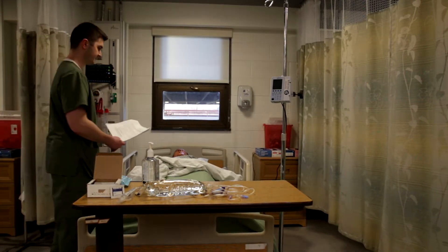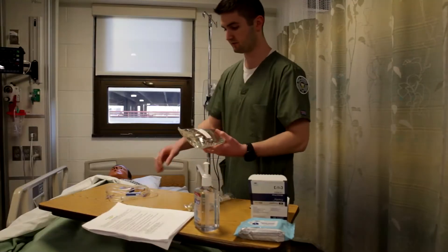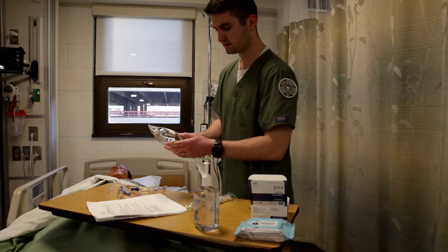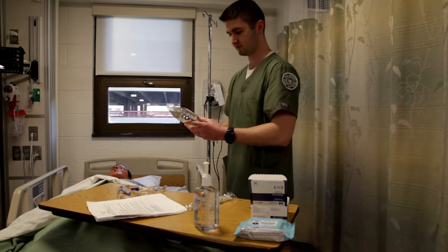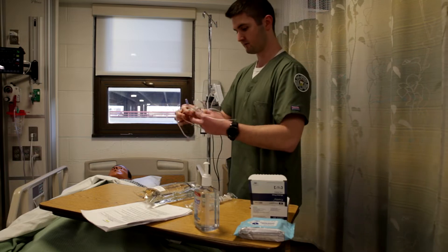ID your patient and check vitals. When you enter the patient's room with the medication, you'll want to check their wristband again against the order, and also compare the medication against the order.